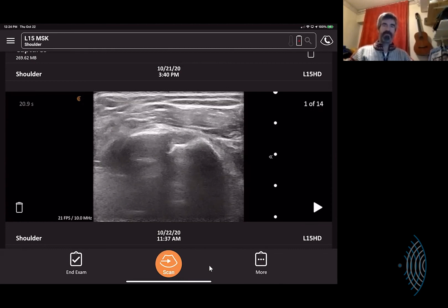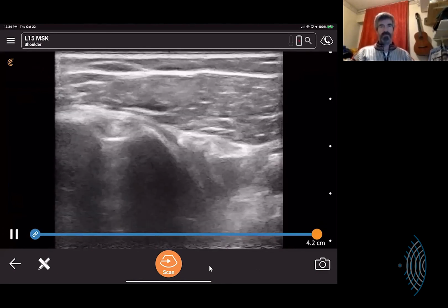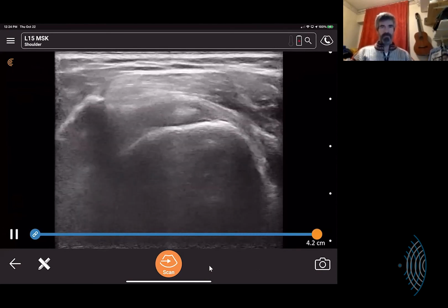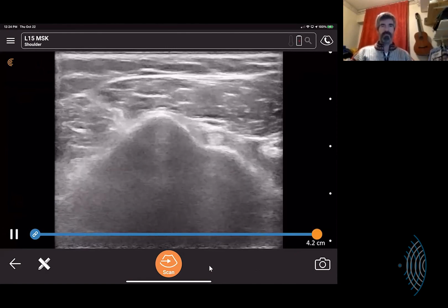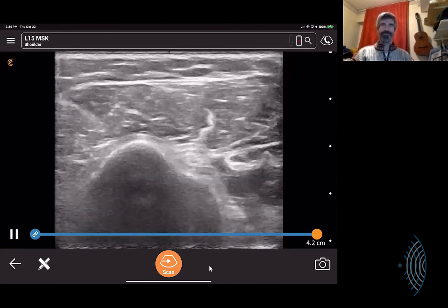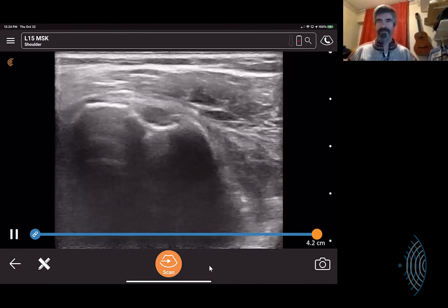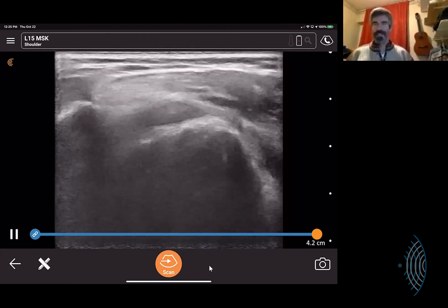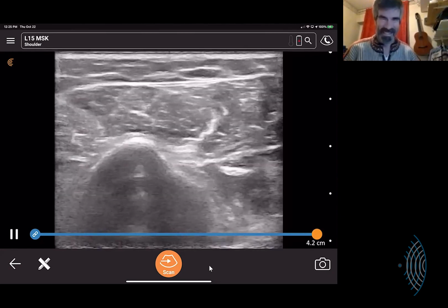So I just want to have your input on this, and let me see if I can even get you to see it. If I do this, are you seeing any movement? So you are seeing me kind of go in and out, attempting to optimize. I'm now at the top and I'm oblique on the long head. Periodically, I will do it correctly, and I'll have some effort to orient the elevation, whatever. Are you seeing it? Now I'm going to write some numbers on here, and I'll give you scores. Good. That will really reduce my fear, John.